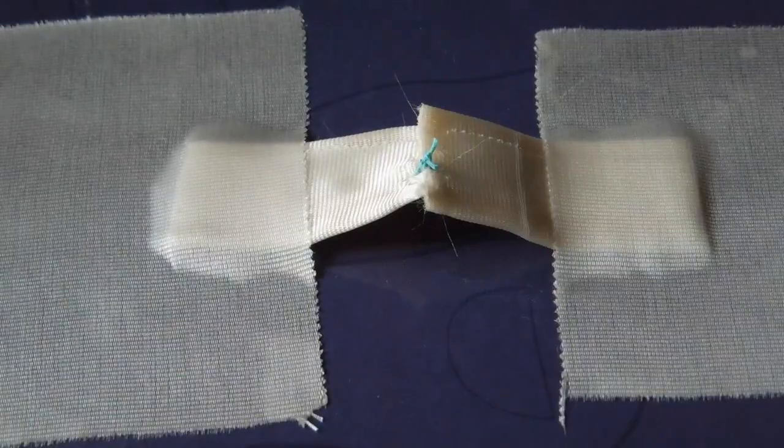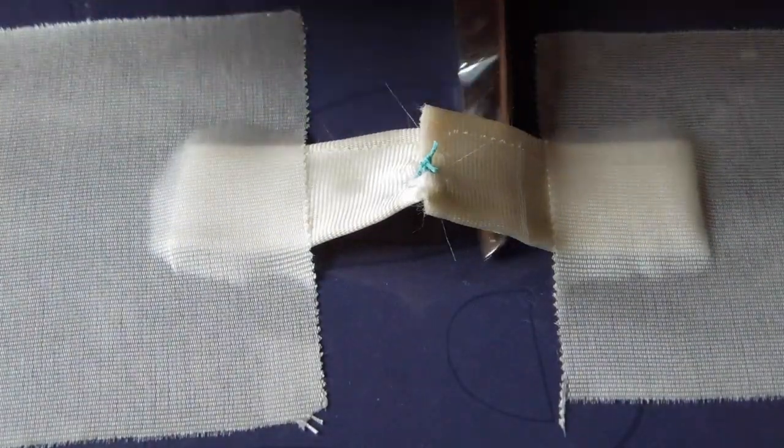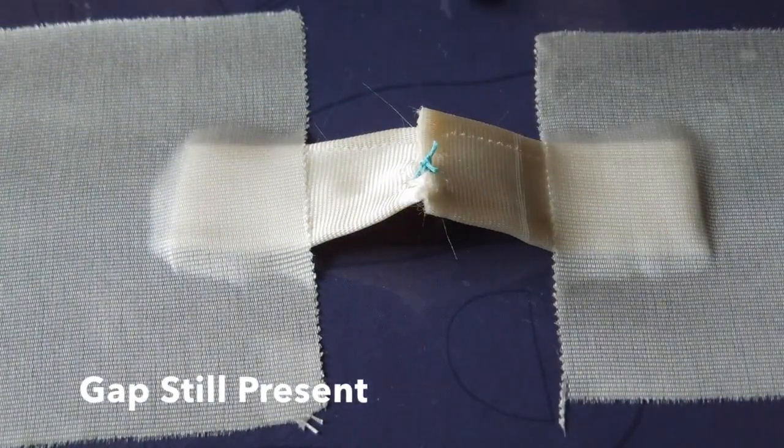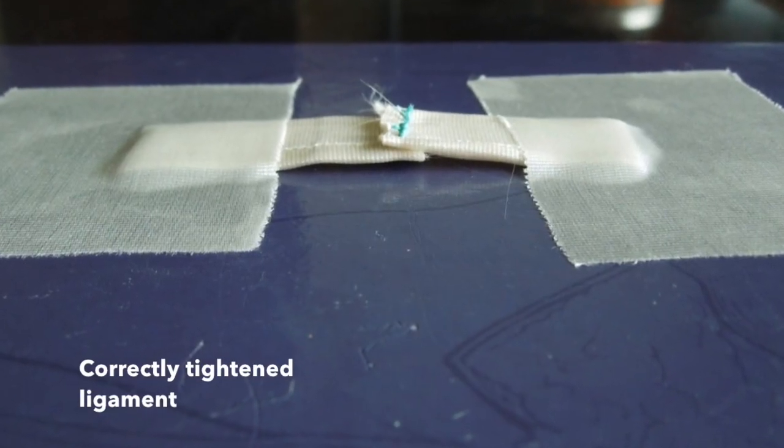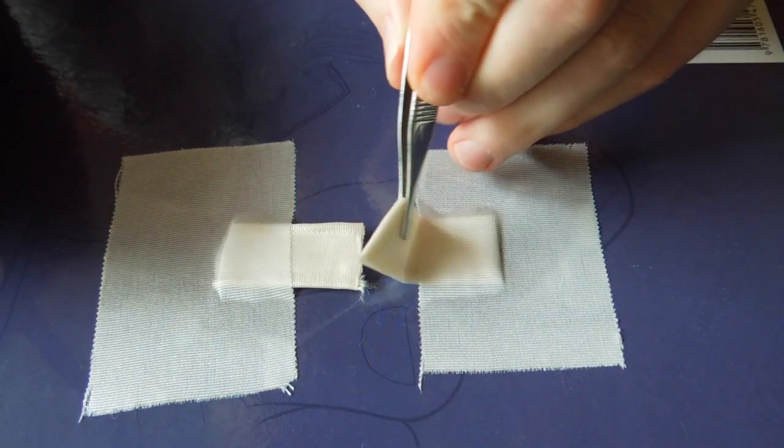The goal of the pants over vest suture is to actually have some overlap and decrease attenuation of the ligament. This is used for a few different things, and here you can see the correctly tightened ligament. That's what our goal is.